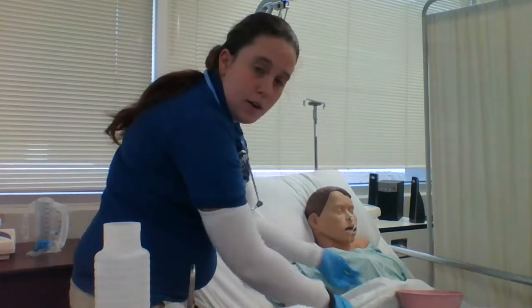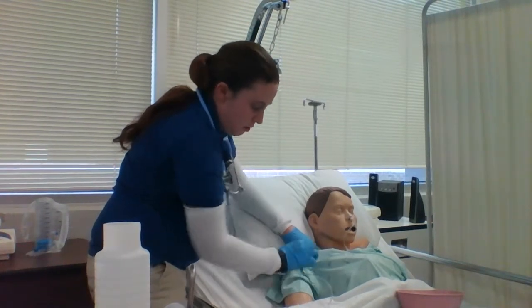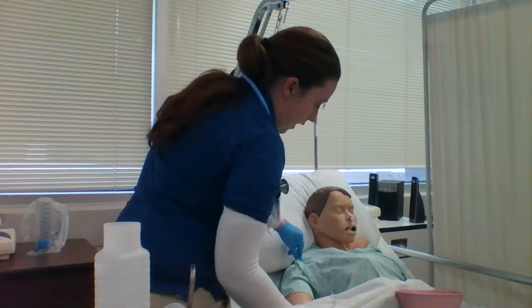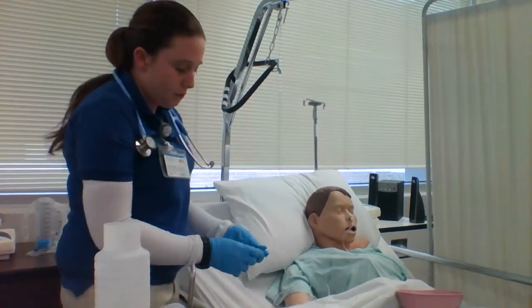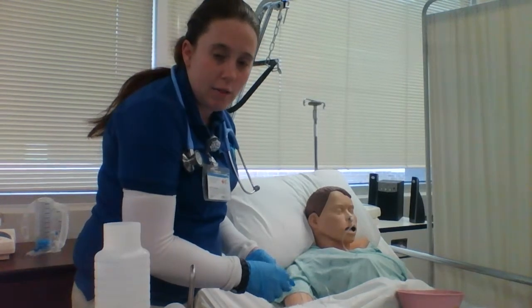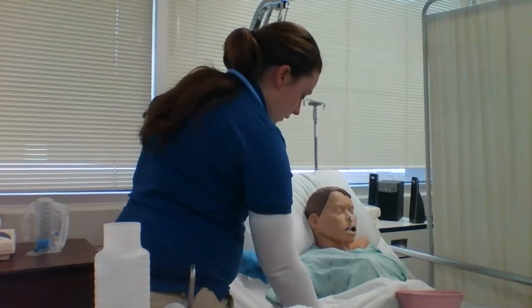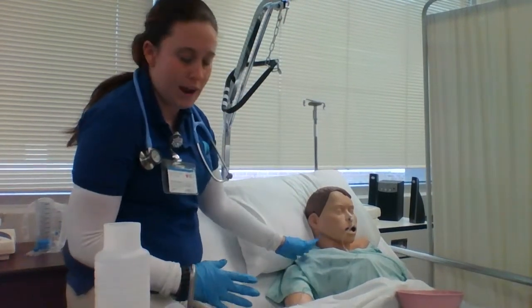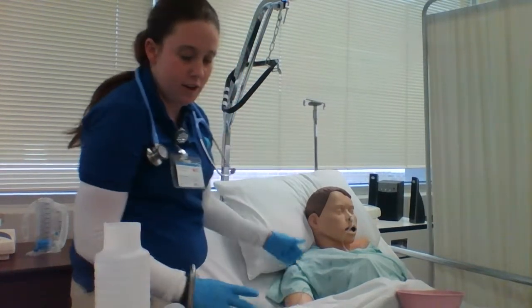And I would pin this to the shirt to prevent any tugging. And now I would go ahead and put this on any suctioning device to the intermittent level that the physician has ordered. The patient would remain in at least a 30-degree upright position.